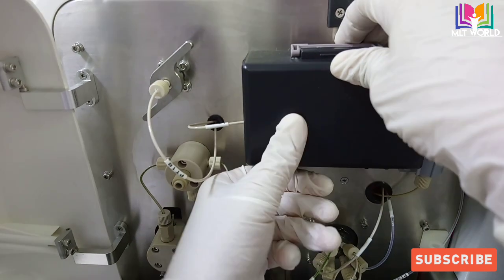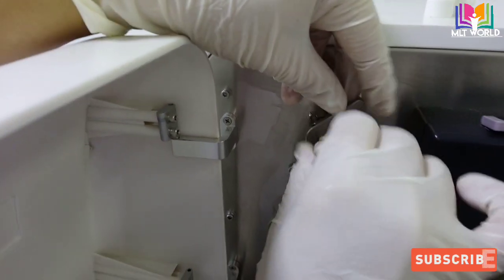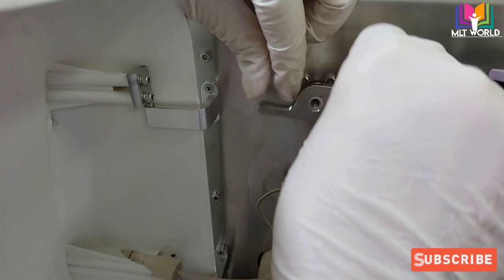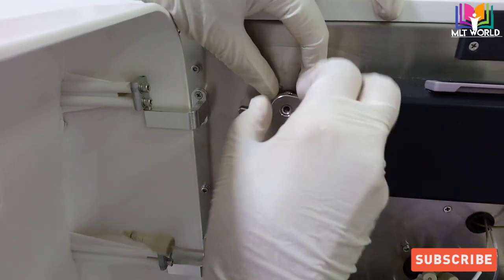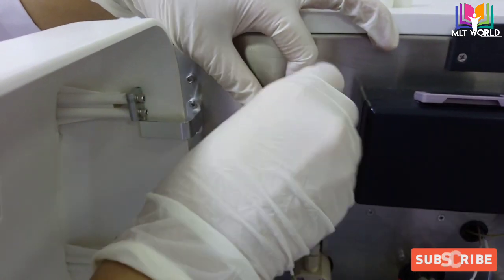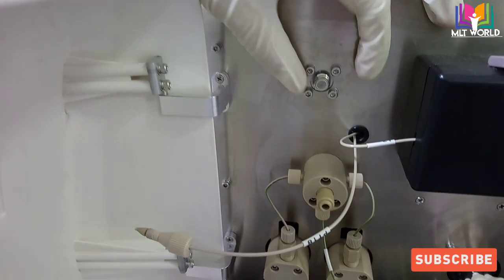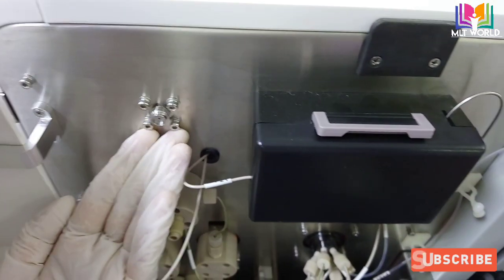Now we will change the filter. There are two filters, each rated for 400 tests, so when the first 400 tests are complete we change to the second filter. We move the knob in an anticlockwise direction to open it. Keep one hand below so the filter does not fall — it will come out into our hand like that.